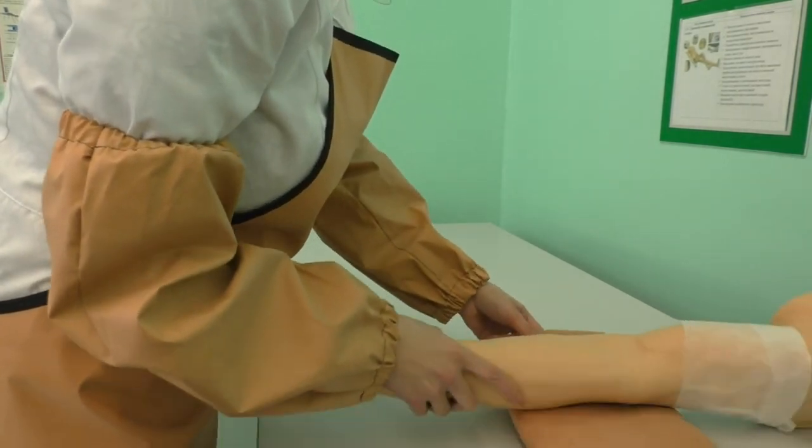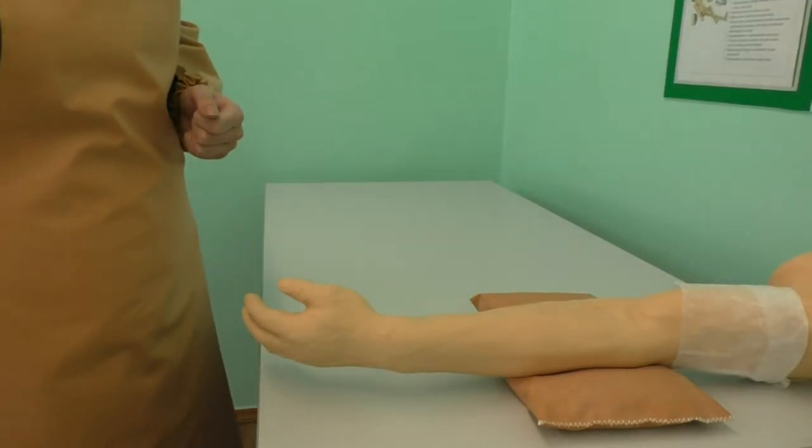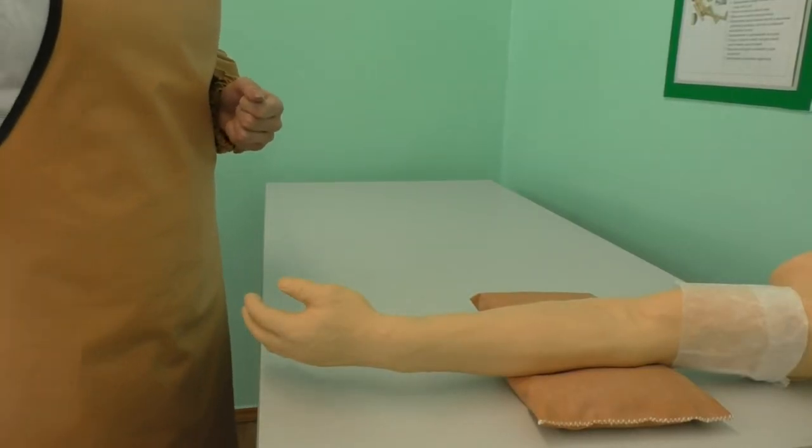Open the packaging with cotton balls. Use the technique from the checklist to draw medicine from a vial or ampoule and prepare the syringe for medication.